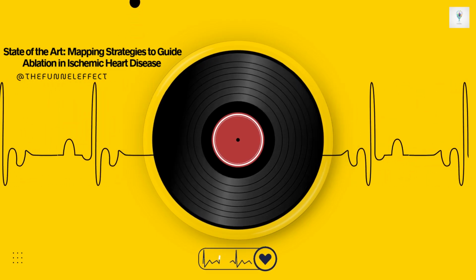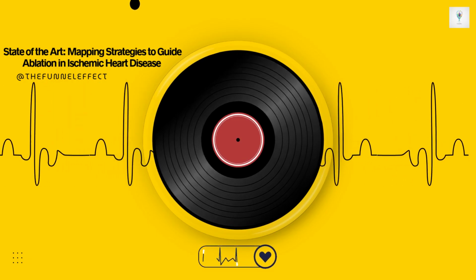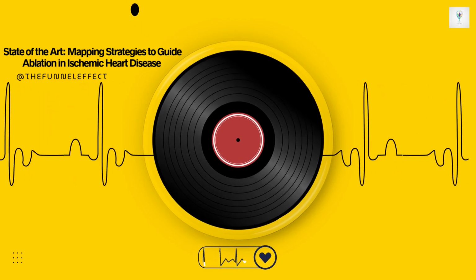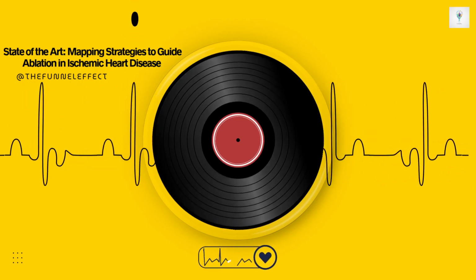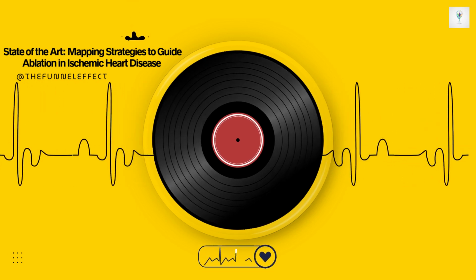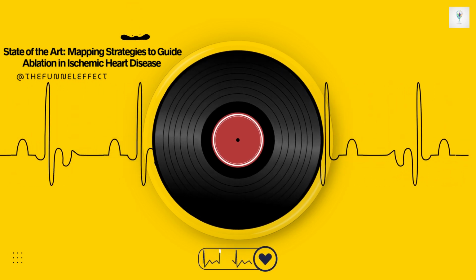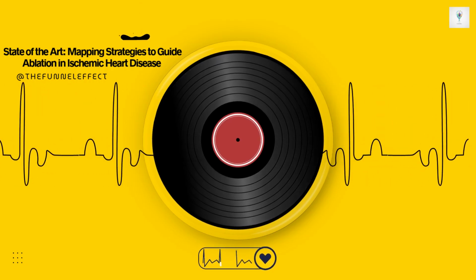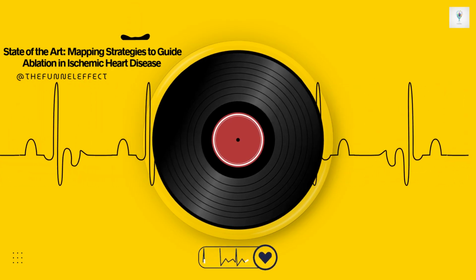The second pillar is VT mapping, and this is where we map during the tachycardia itself. This is the real-time, high-def approach. It's definitely riskier, like we just said, but it's incredibly specific. You're literally tracking the live reentry wave, watching it circulate, trying to pinpoint that critical isthmus while it's active. When would you choose this riskier approach? It becomes necessary in certain situations.